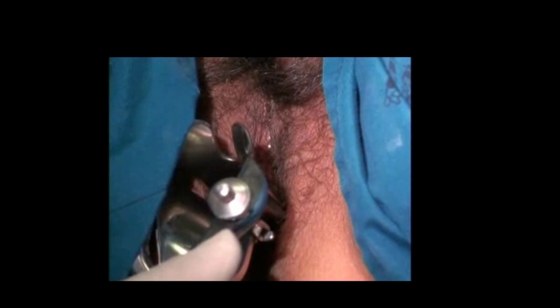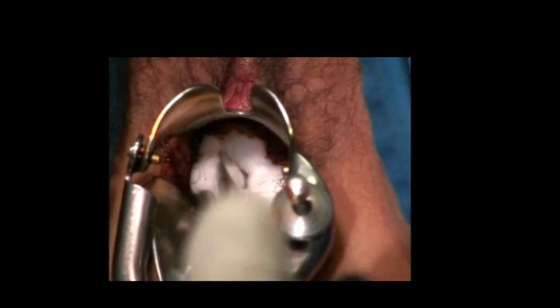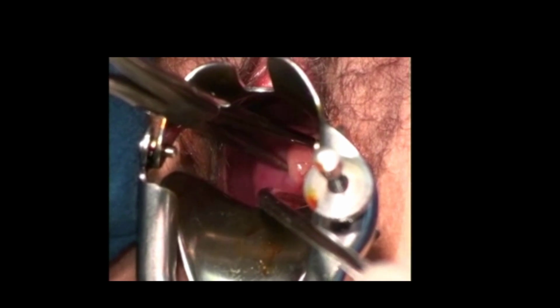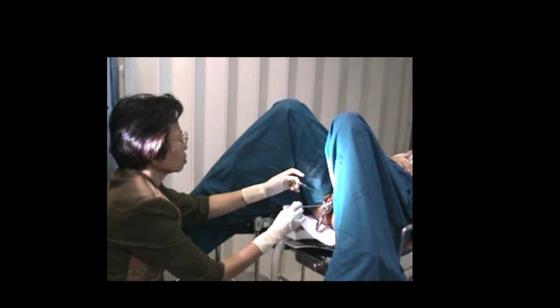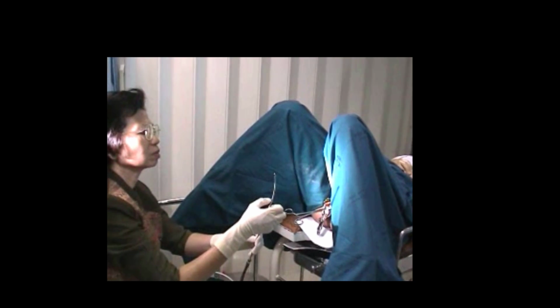Insert the speculum into the vagina to have a clear view of the cervix. Cleanse the surface of the cervix with an antiseptic swab. Grasp the upper lip of the cervix with a tenaculum forceps to allow, if needed, application of gentle traction to straighten the angle between the cervical canal and uterine cavity. Assess the angle of the cervical passage and depth of the uterine cavity by gently inserting a uterine sound through the cervix until you feel the sound has touched the fundus. Note the depth of the uterus by counting the number of notches on the sound visible from the cervix.